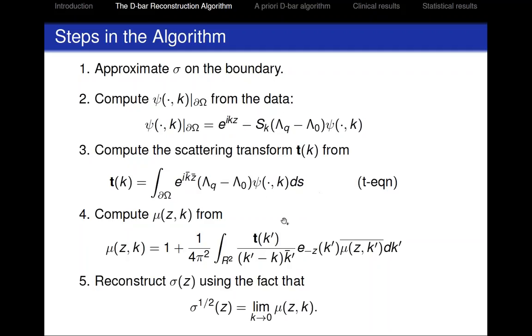It involves solving a little series of integral equations and then just evaluation at the point k equals 0. So just to tie back to a couple things I said about it, the mesh independent piece is that notice no matter what mesh you choose to evaluate or approximate your sigma on, this ends up getting solved at each point z independently. So you don't have this relationship like you do in least squares methods between posedness and mesh size. You just evaluate at each z you want to. Which doesn't mean you can get infinite resolution here, it just means that it's independent of mesh.